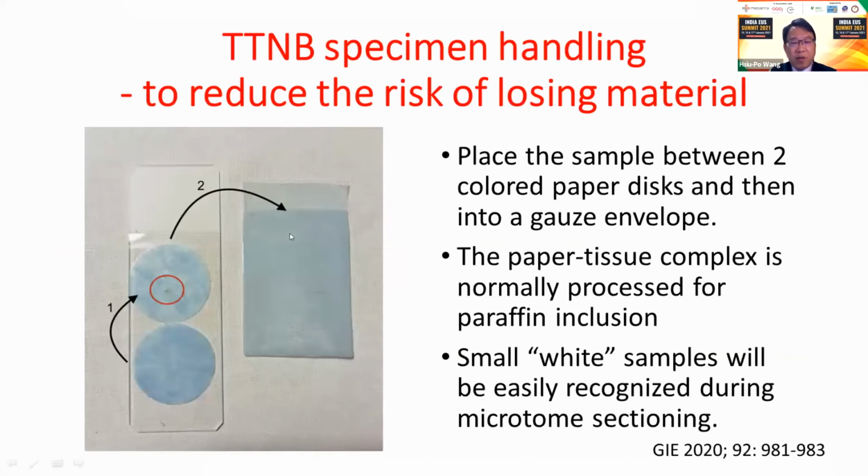So Dr. Ripper Corin has suggested a method for handling through-the-needle biopsy specimens to reduce the risk of losing material.